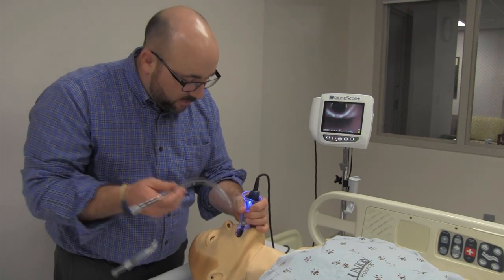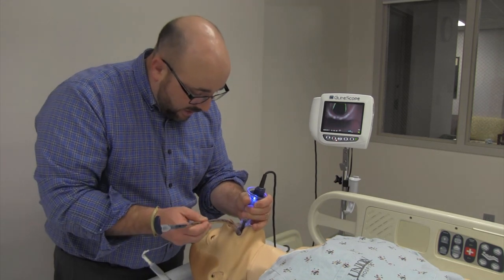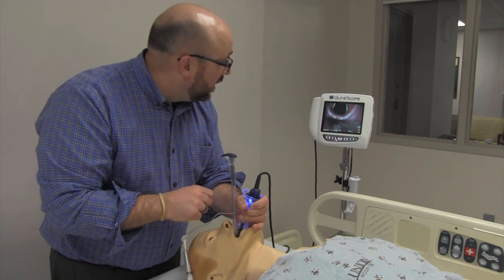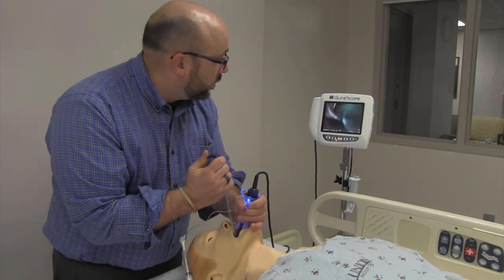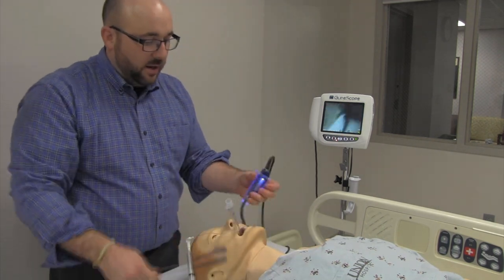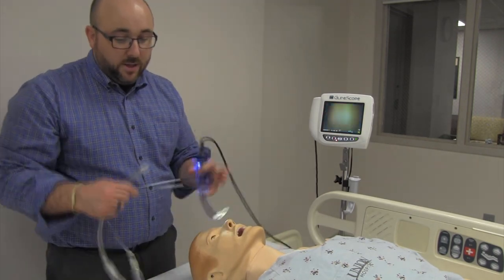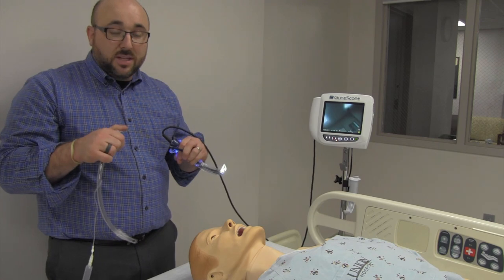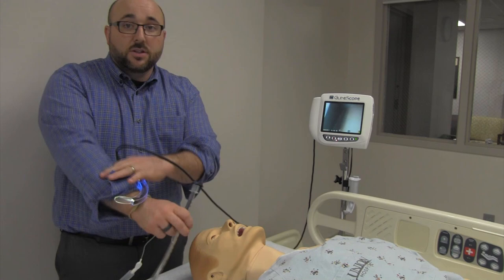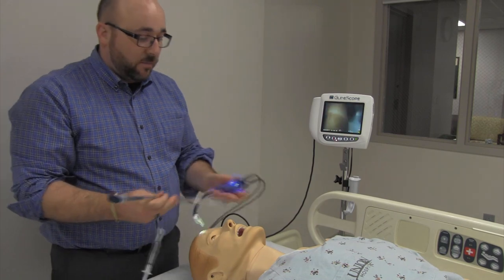Here's a replay of the four-step method at three-quarter speed. Number one: insert the GlideScope, look at the mouth. Number two: look at the monitor, see the cords. Number three: insert the tube, rotate around the corner, still looking at the mouth, then look back at the monitor for number four. Adjust it, pop it, and insert it. If anyone questions whether the tube is in, you can go back in and verify — especially after a really hard intubation, just show everyone it's in the right spot.